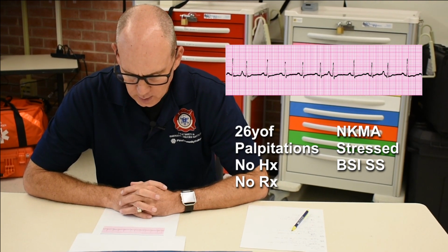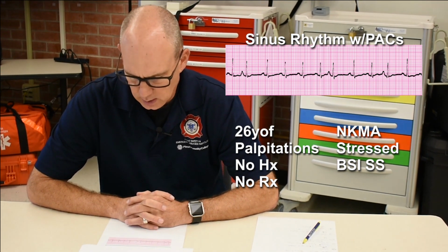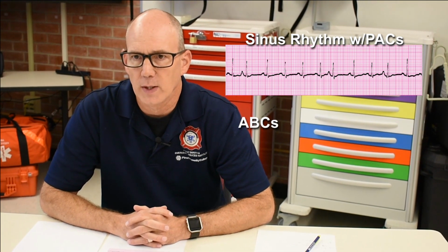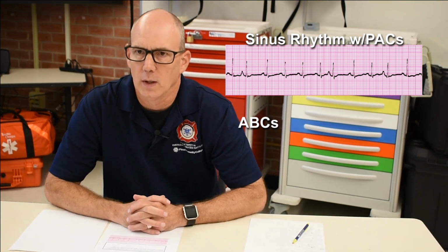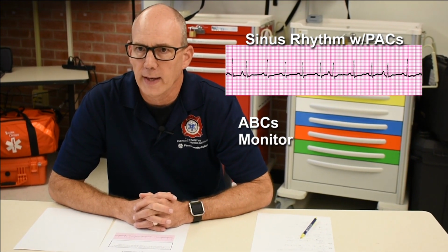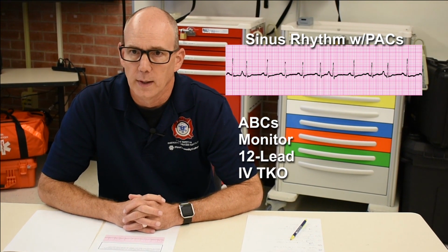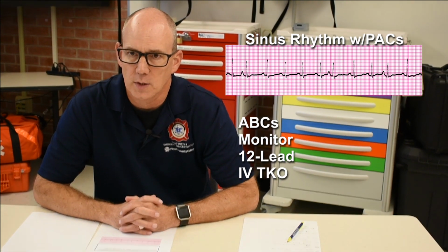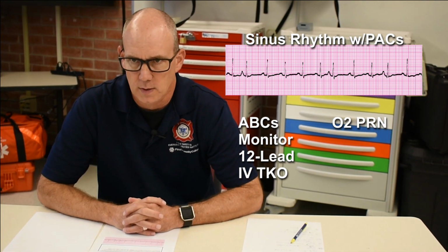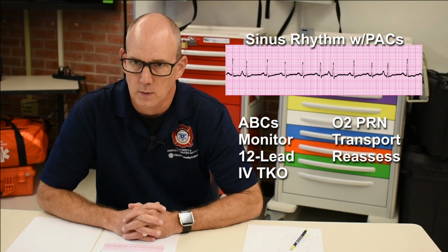My rhythm is sinus rhythm with premature atrial contractions, or PACs. So first I'm going to consider my patient's ABCs, make sure she has a good airway, is breathing well, and has adequate circulation. I'm going to place my patient on the monitor and obtain a 12 lead. I'm going to start an IV TKO. I'm going to make sure my patient's oxygenation is between 94 and 99% and provide supplemental oxygen if necessary. I'm going to transport my patient to the hospital and reassess en route.